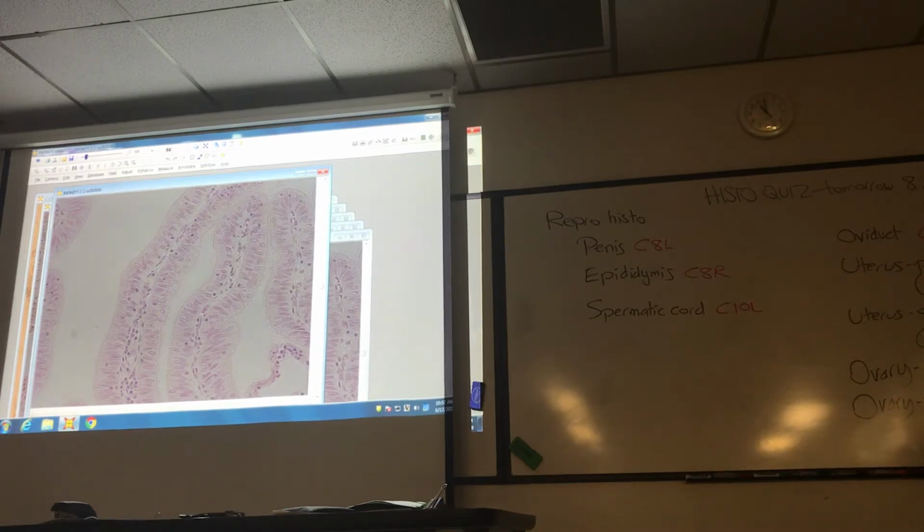Okay, yeah, I think I changed that yesterday because I knew I was going to see that. So stick with what you see on your quiz tomorrow if I have you identify that. Go with the pseudostratified columnar epithelial tissue. So I'm going to move away, and it is ciliated, yes. I'm going to move away from that and go to the uterus.